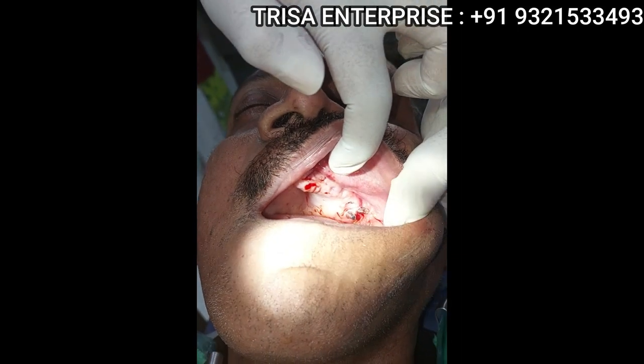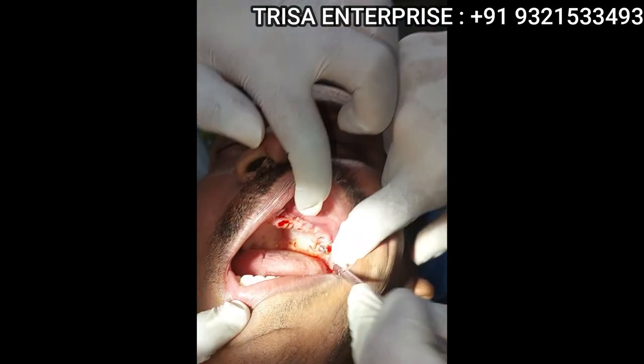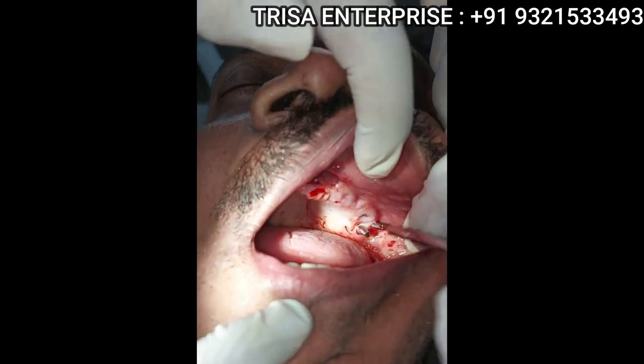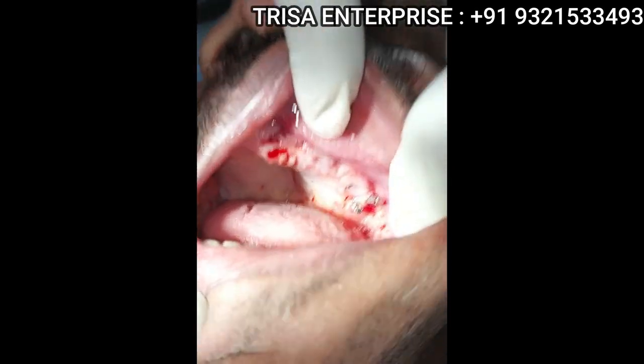Now if you see, this is one buccal, one palatal — one buccal, one palatal.